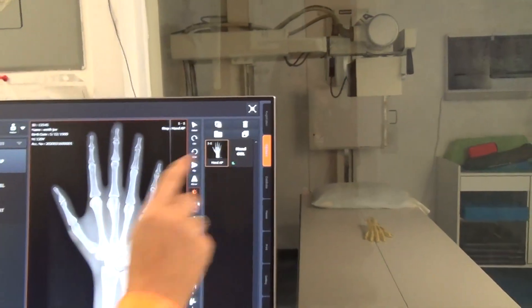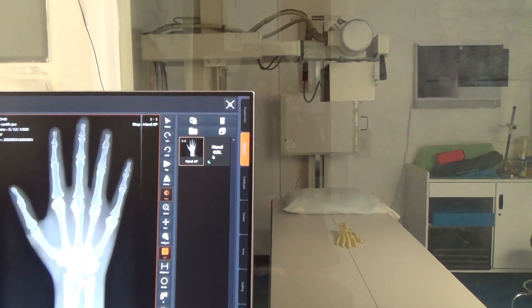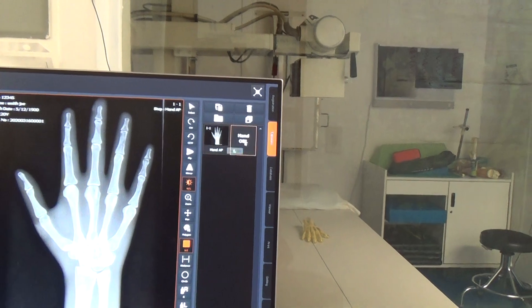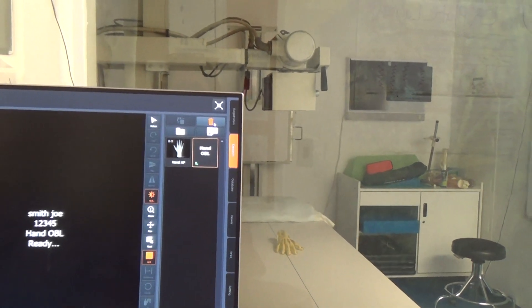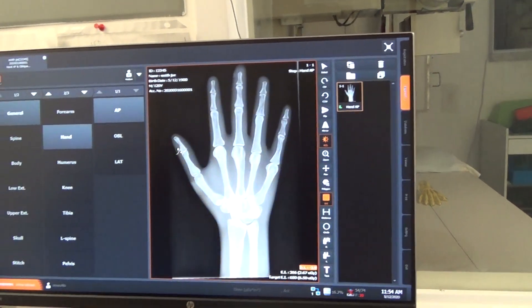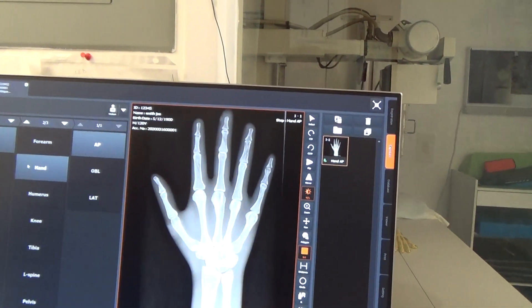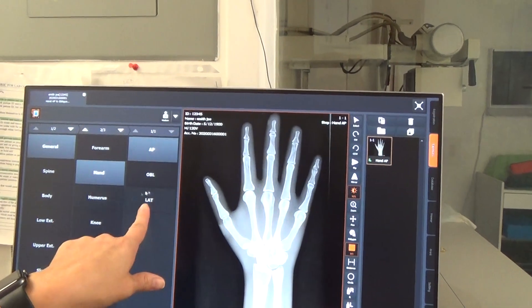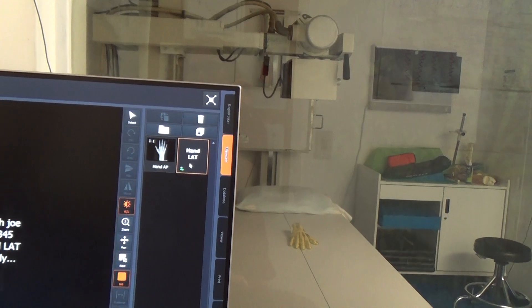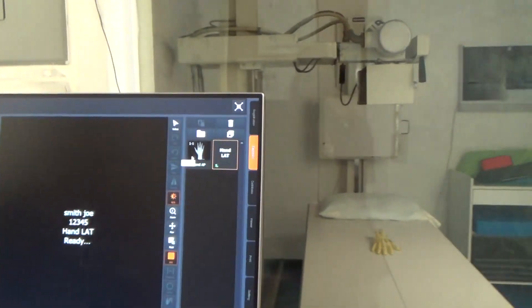Now, if you want to do another hand x-ray on this one, you can go ahead and cue it up. If I wanted to do this hand in an oblique position, I could. If I change my mind and said I don't want it, just click it and stick it in the garbage. If I wanted to put a lateral instead, I've got my hands chosen. Instead of AP, I'm going to choose lateral — see it comes up on the side, it cues it up. I click it, and then I would go back over, reposition my patient, and take the other exposure.